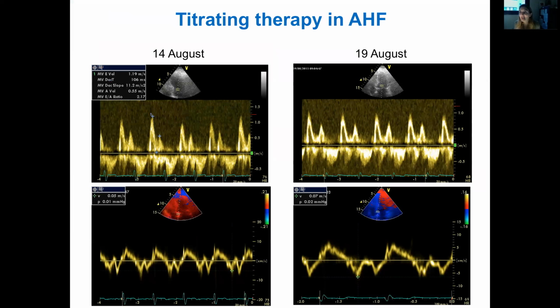And again, going back to our patient with heart failure with preserved ejection fraction, it's very nice to see that in that case we can use lung ultrasound not only for the diagnosis but also for the monitoring. If you see the difference between the day he came to my ambulatory office, when I didn't tell him to be hospitalized, I just increased his home therapy and told him to come back after 5 days. And after 5 days, all the signs of diastolic function were improved.